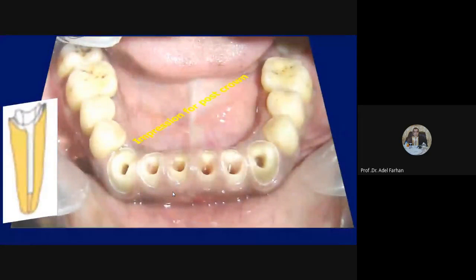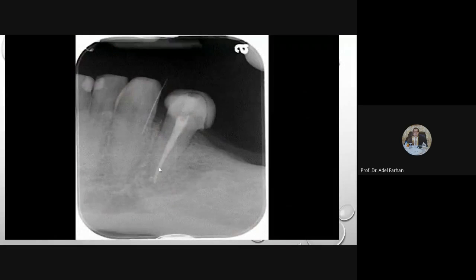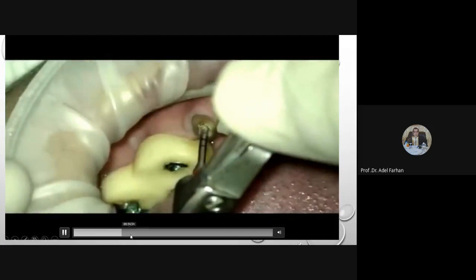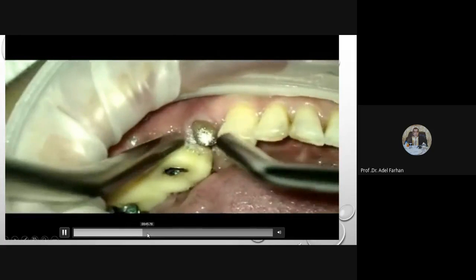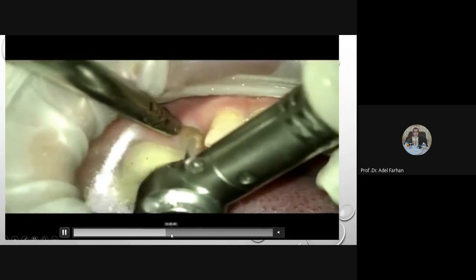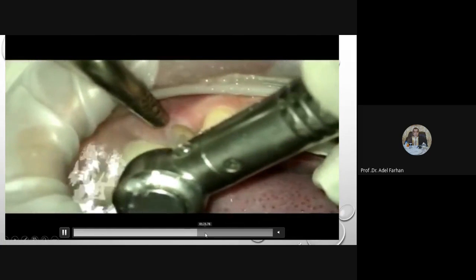اكو فيلم انا بس اشوفكم سريع تشوفوه، الامبريشن مال البوست كراون. طبعا هذا هنا بريبريشن البوست كراون سريع نمشي لكم اياه. كان المهم الامبريشن مثل ما نشوف. طبعا after the preparation of the canal نمشي لكم اياه سريع لان احنا المهم عندنا الامبريشن الحقيقه.